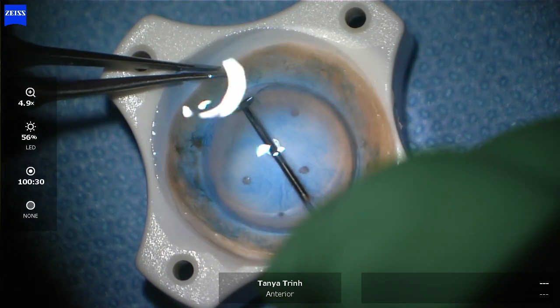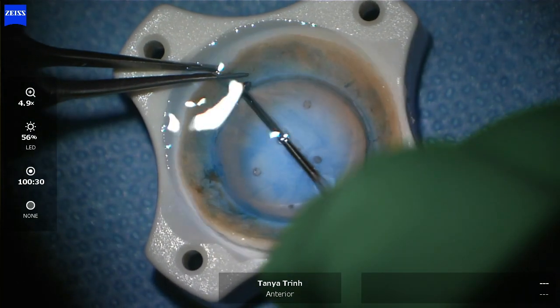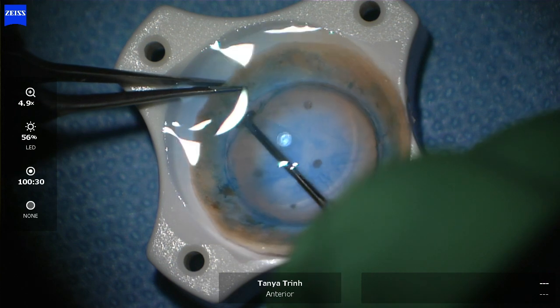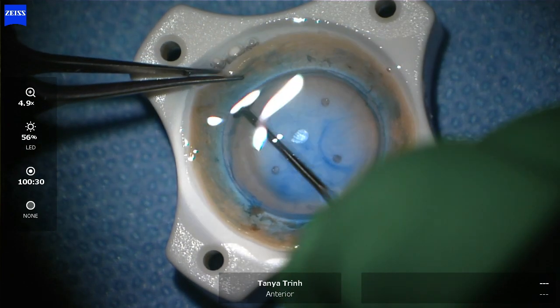So as not to squirt or have high turbulence across the surface, because we don't want to be losing any endothelial cells. I'm now using a Rootman-Sloan LASIK hoe and I'm gently separating and working my way around in a 360-degree manner — the separation between the Descemet membrane and endothelium and the stroma.